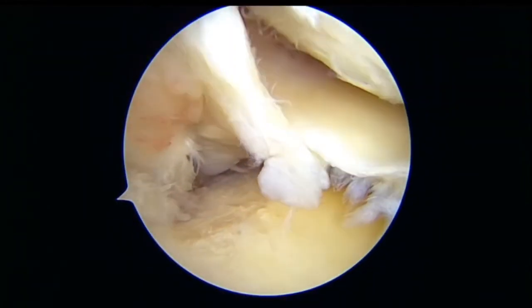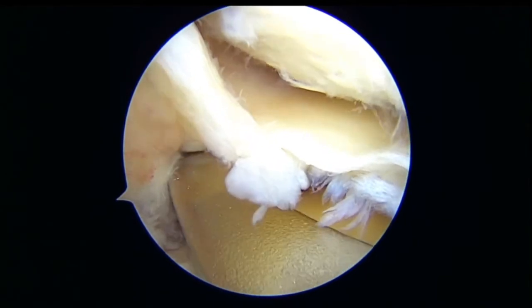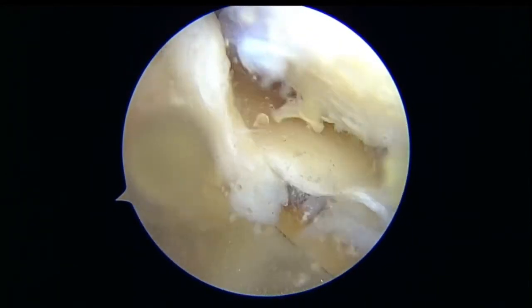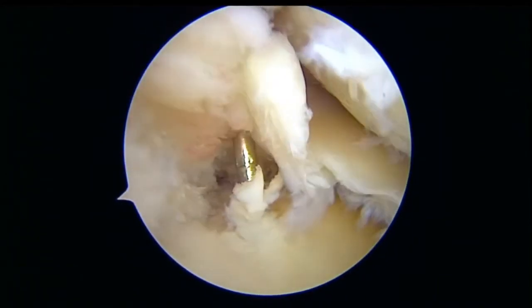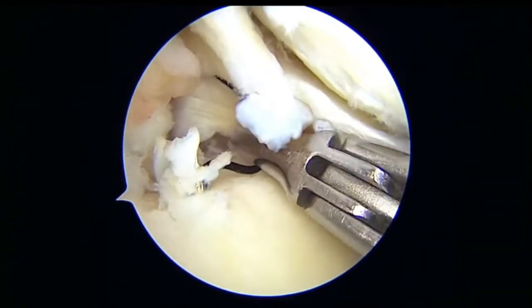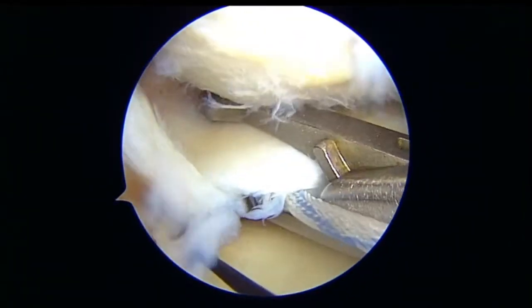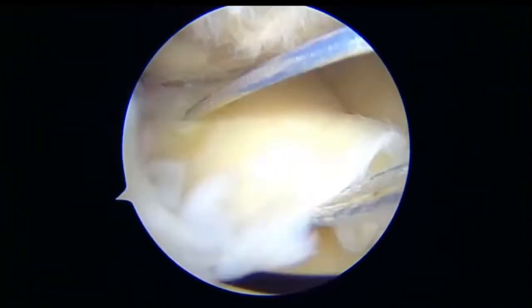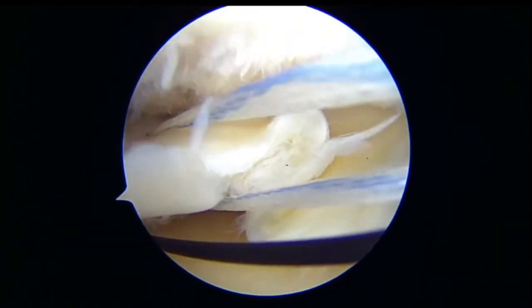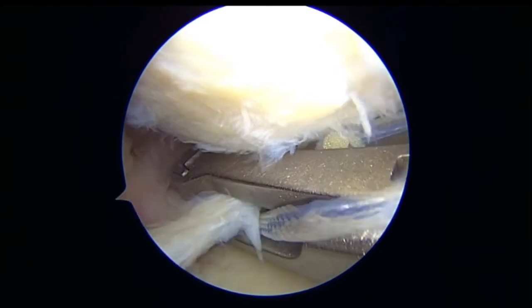I like to do a little bit of burr so that the bone bleeds there and helps in healing. Then with a meniscus root jig, we do a 2.5 drilling. Then with an antegrade device, we take a 0.9 mm suture tape and take bites through the meniscus.